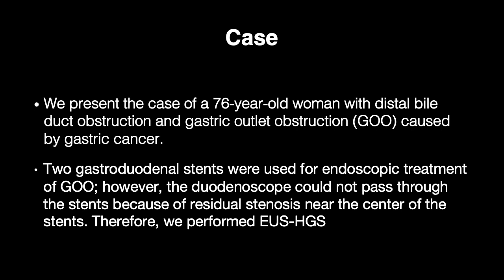We present the case of a 76-year-old woman with distal bile duct obstruction and gastric outlet obstruction caused by gastric cancer. Two gastroduodenal stents were used for endoscopic treatment of GOO. However, the duodenoscope could not pass through the stents because of residual stenosis near the center of the stents. Therefore, we performed EUS-HGS.